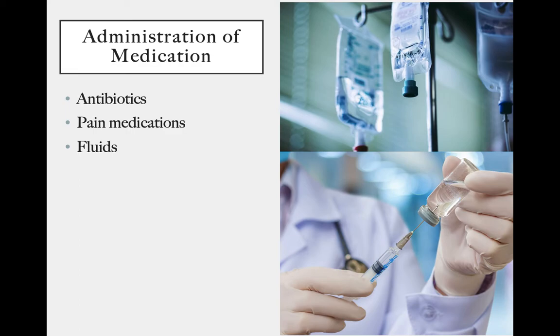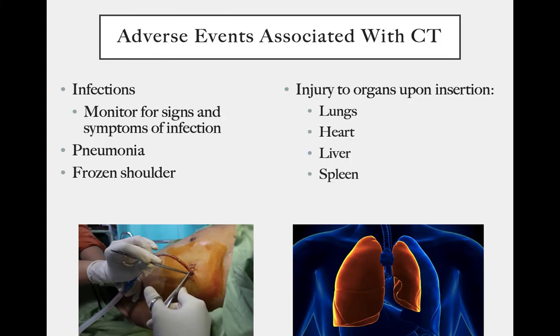Additionally, we would be using pain medications. As I said, it's an invasive procedure. This can be quite painful to the patient, so we would be administering that. And then lastly, we may be administering fluids. So individuals with a pleural effusion or a hemothorax will be losing fluid, and we want to ensure that we maintain the fluid balance.